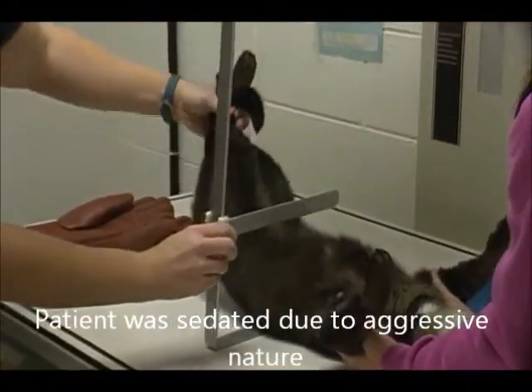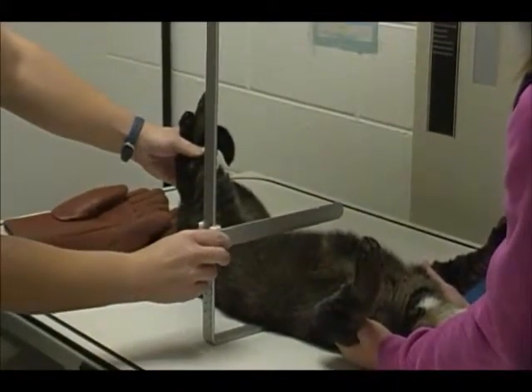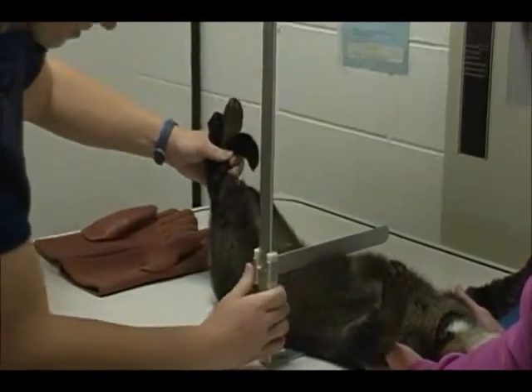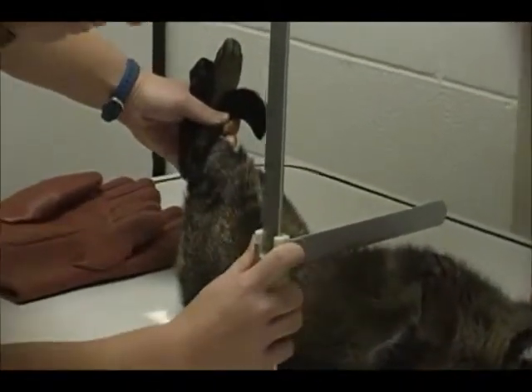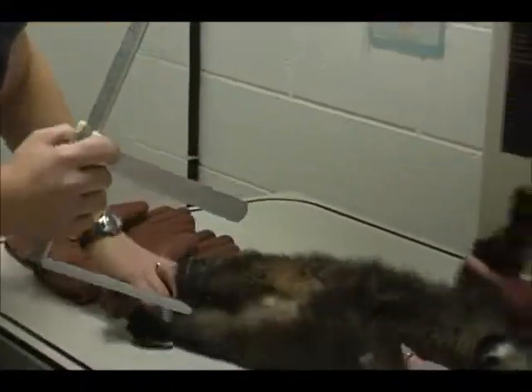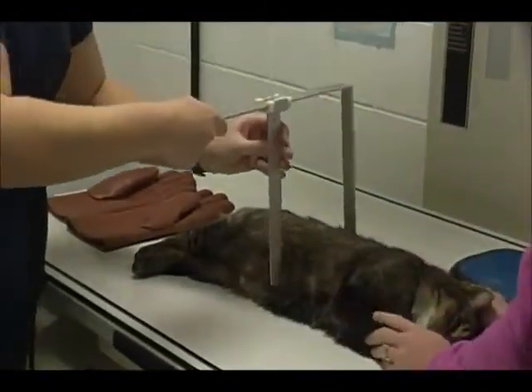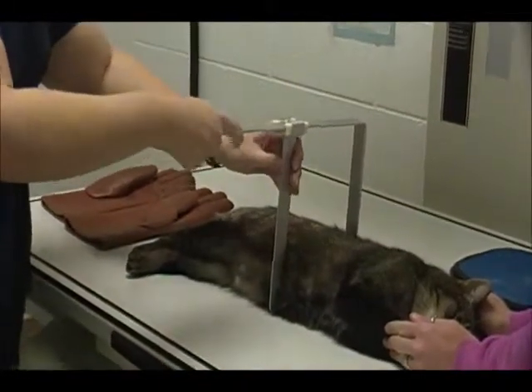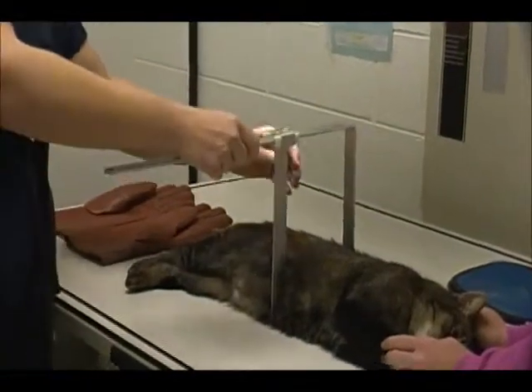We're going to measure the widest part over his abdomen, and we determine that to be about 11 centimeters. And then for the lateral, we're going to measure, and that's going to be about 12 centimeters.